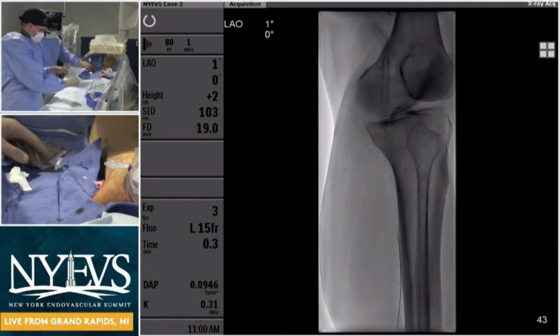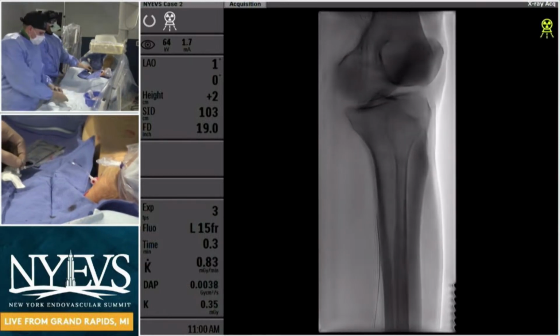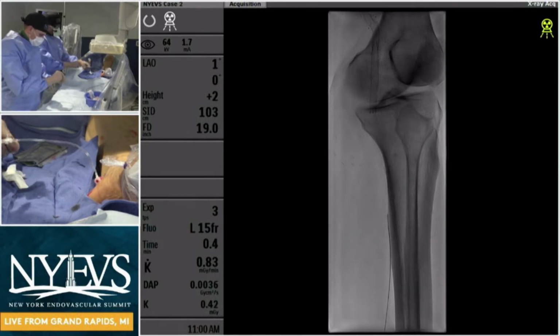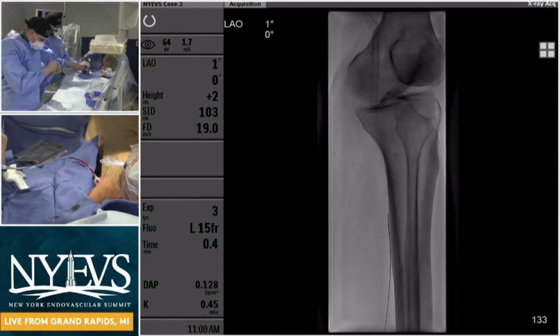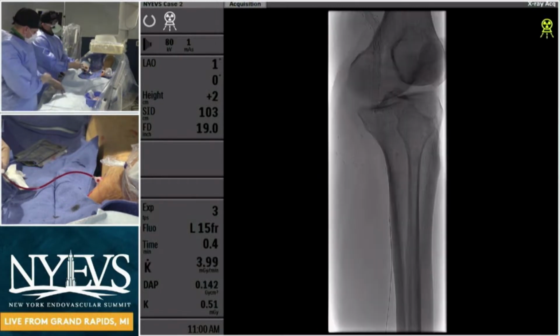The other thing, as a surgeon, we can do a tiny cut down, access the graft, close that graft probably with a tiny little wound, like a varicose vein excision. So other options are there. Yeah, that's what I was going to ask. And avoid the groin, redo groin access, which I agree, I think we should stay away from.